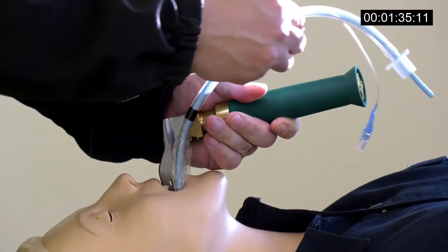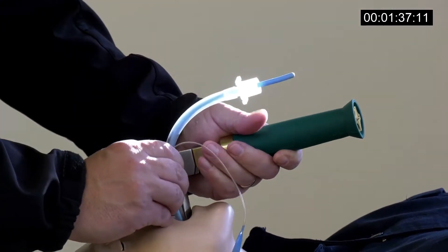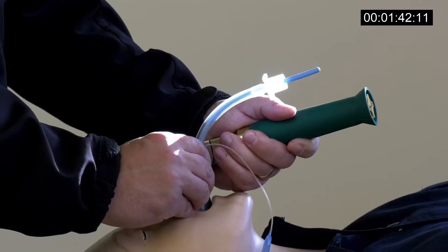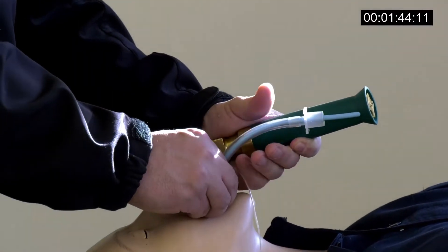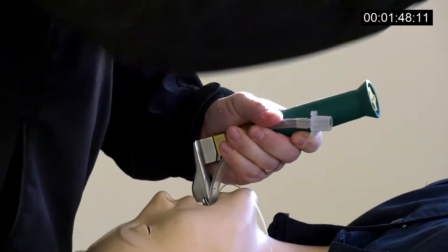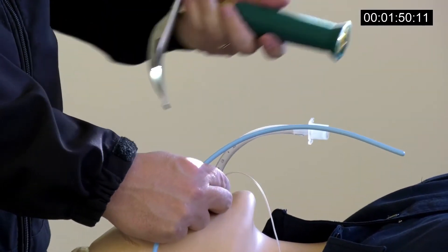Then I come back again and drop the tube in, and I just float it in. I can see the Eshmann out the other end the whole time, so I'm not too worried about holding on to the Eshmann until I get to where I need to be. Then I grab ahold of it again like this and lock it in, and then I just pull the Eshmann back out, and then I bring my blade back out.